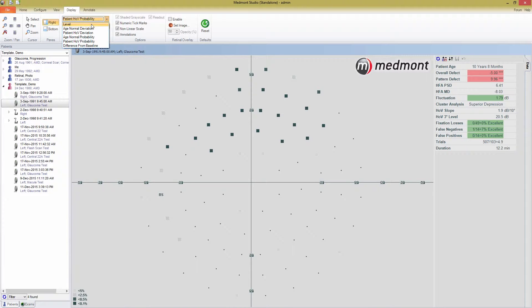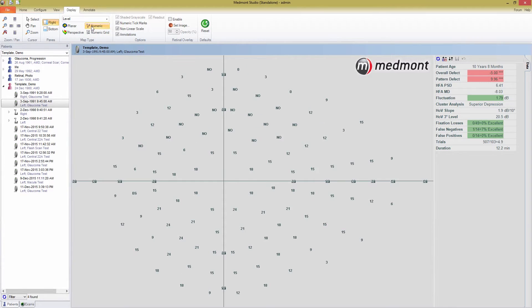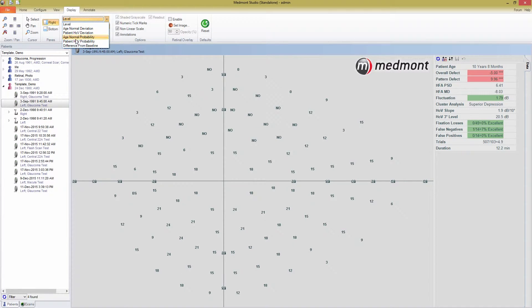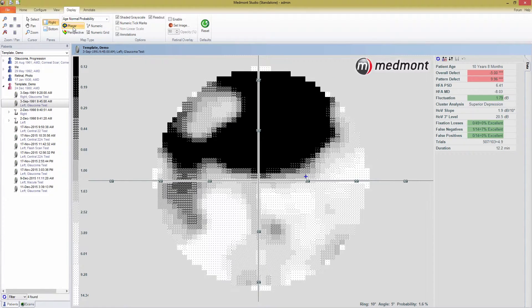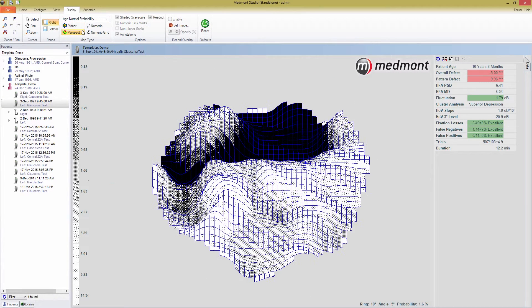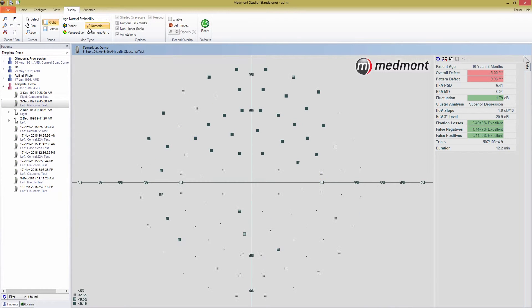A very important point to note is that all of these map types, other than those taken using threshold levels, provide the most data when viewed in numeric view. Because they are not displaying just levels, but have unique legends, the planar and perspective views do not fully show the intended display of the data. It's important to make sure you're viewing the correct maps with the correct displays, as well.